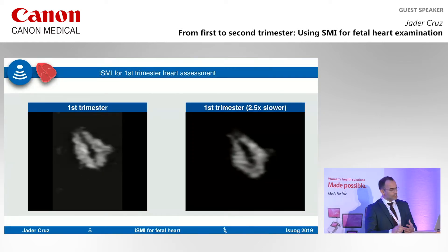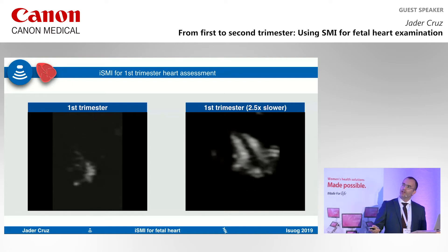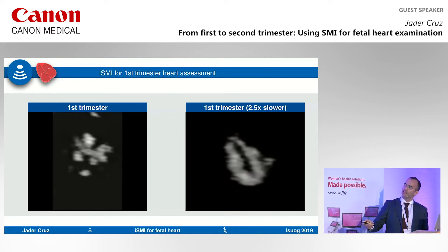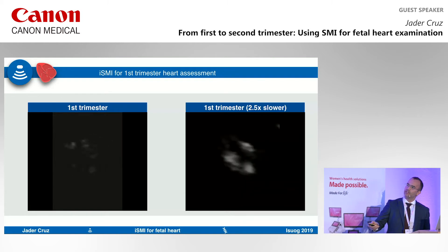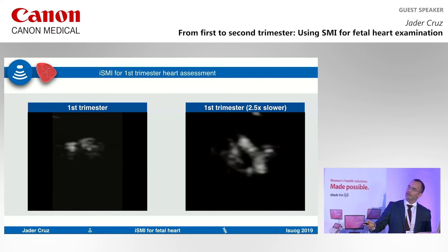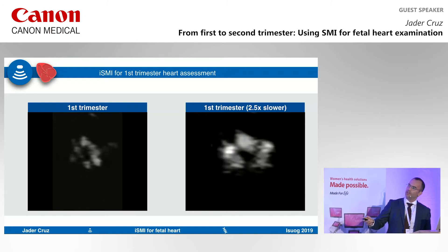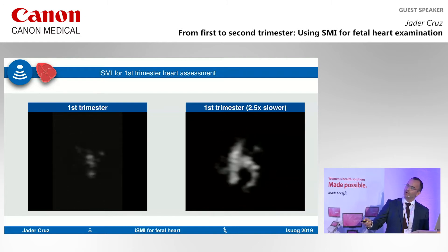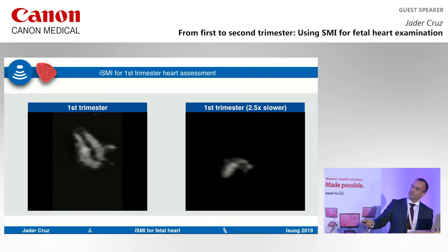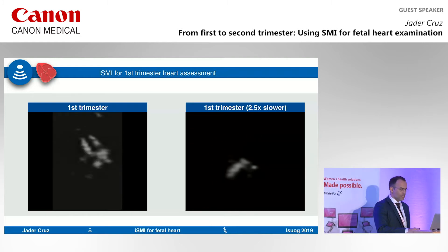This is a first trimester sweep of the heart shown at a slower speed so you can see the details better. You can very clearly see the interventricular septum, the aorta, the pulmonary artery coming in with its branching, and then the three vessels — including the superior vena cava.